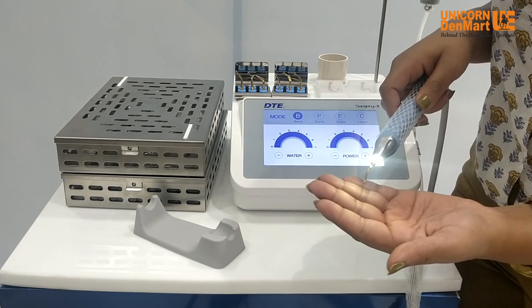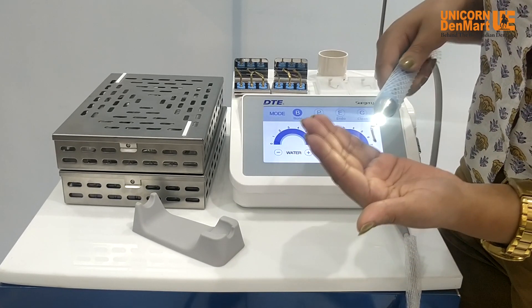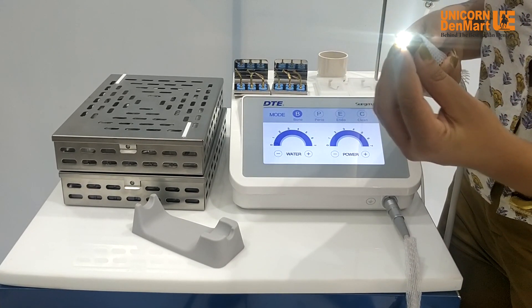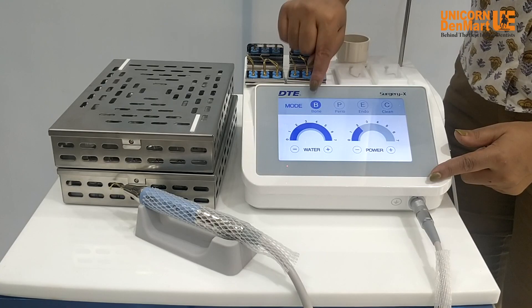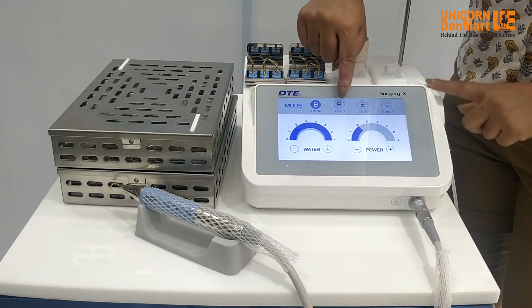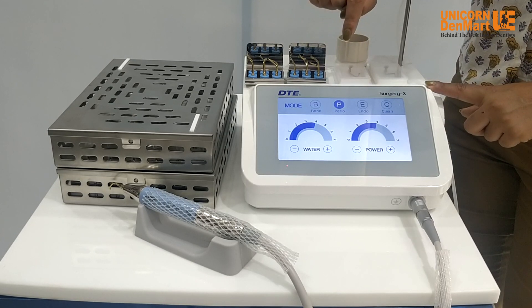Equipped with two LED handpieces with cord, which are highly temperature resistant, delivering 70 watt power modulated by selectable modes for various operations. Bone mode, or cutting mode, is used for bone cutting or surgeries; periodontal mode is for deep scaling, root planing, and curettage.